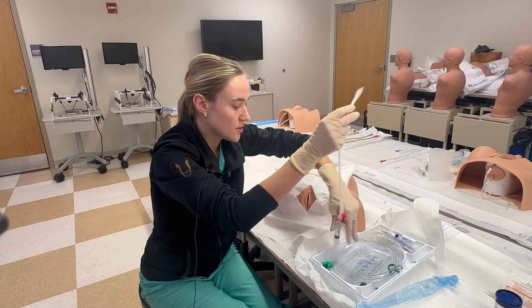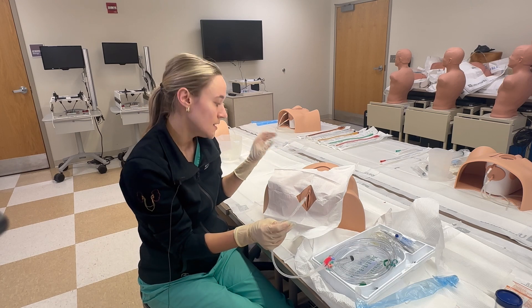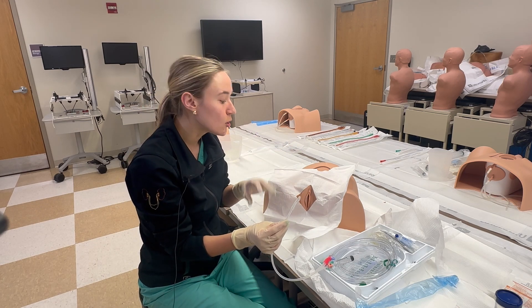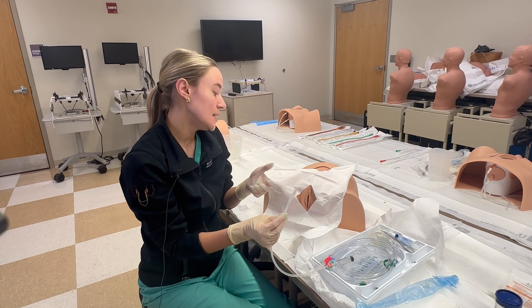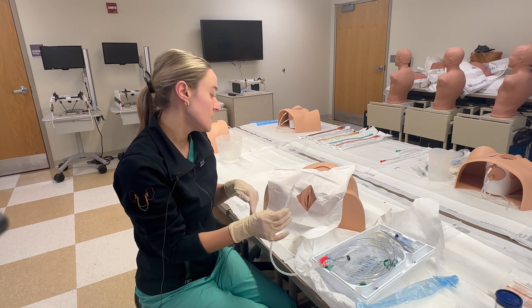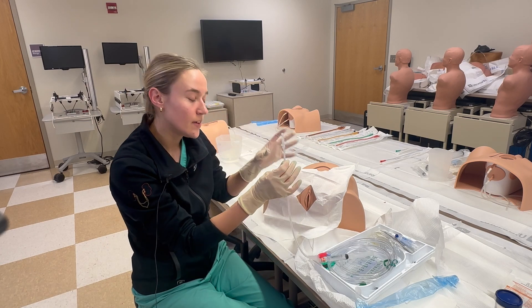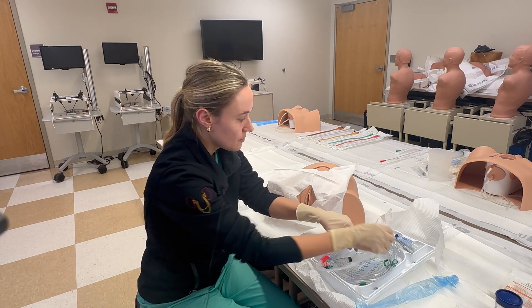An important thing to note before placing it: this is a very normal anatomy. We'll go through troubleshooting tips if that's not the case for your patient. Some things you can do to improve the likelihood of getting it in: you can inflate the bed if that's an option, or take a bedpan and place it underneath the hips of the patient to increase visualization.